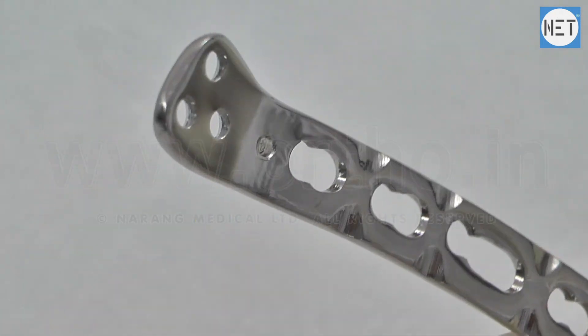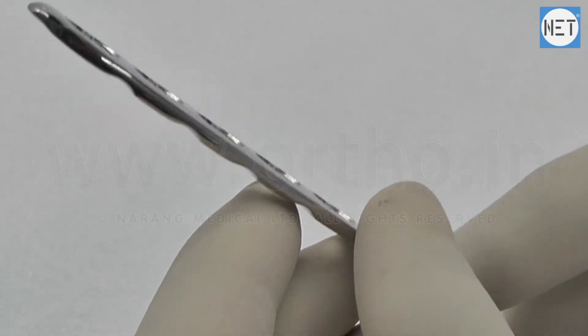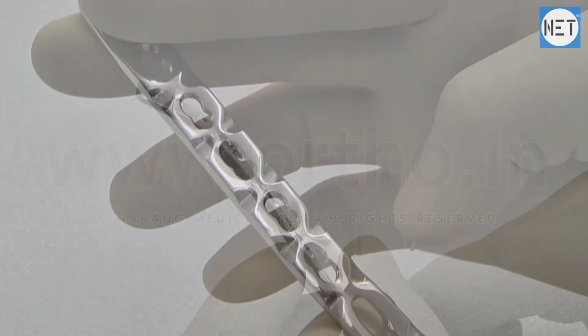Anatomically shaped plate fits over the lateral condyle of the humerus from dorsal side. Safety locking feature provides the angular stability.